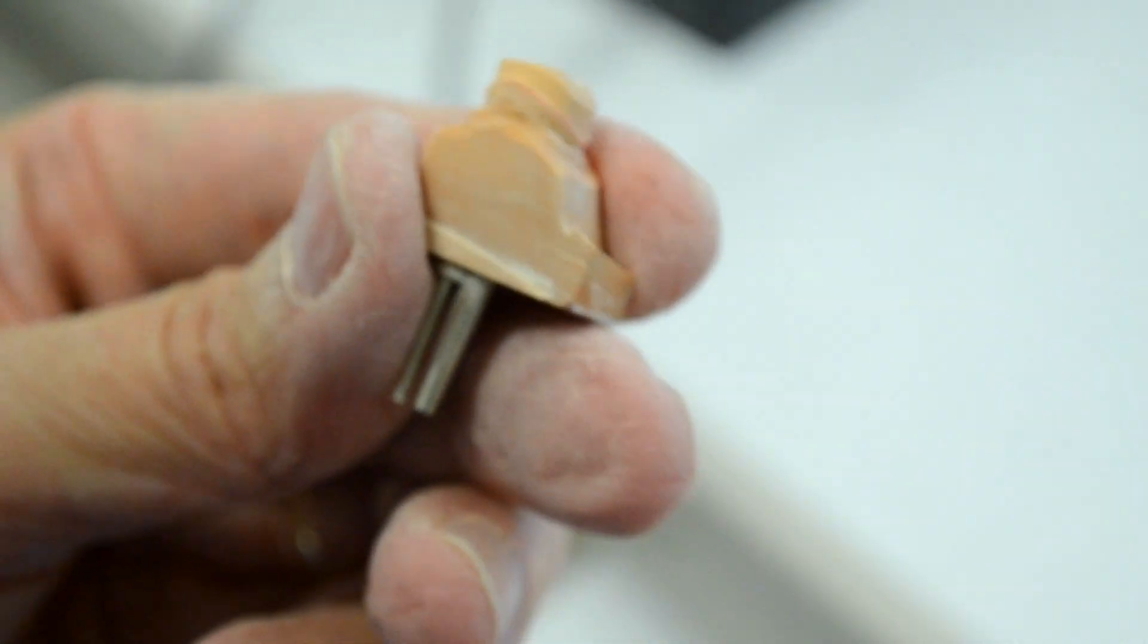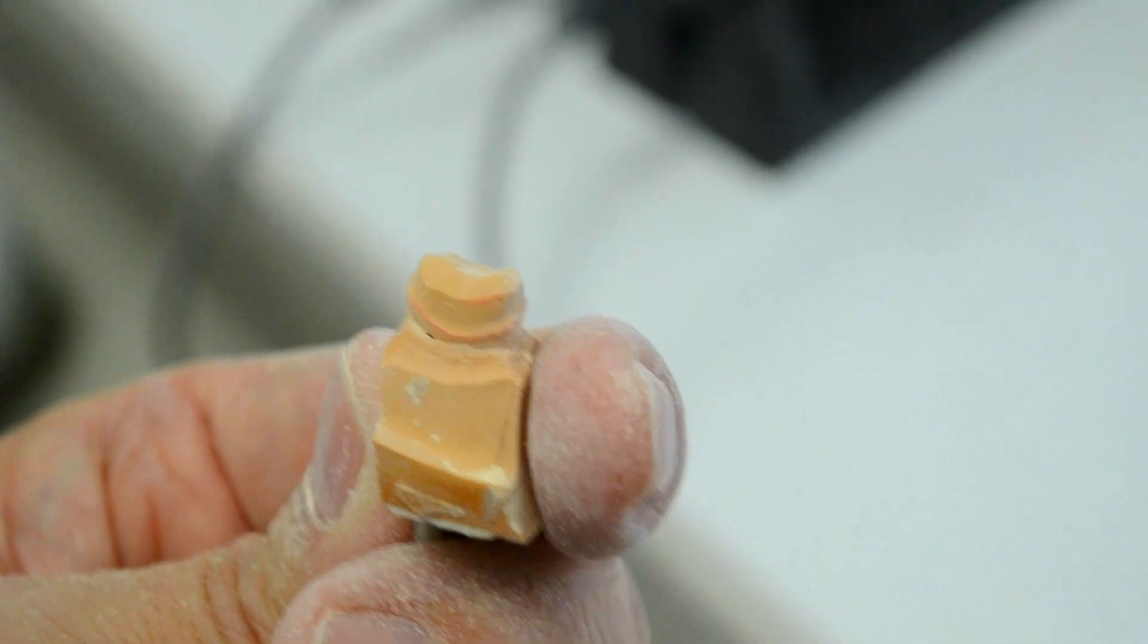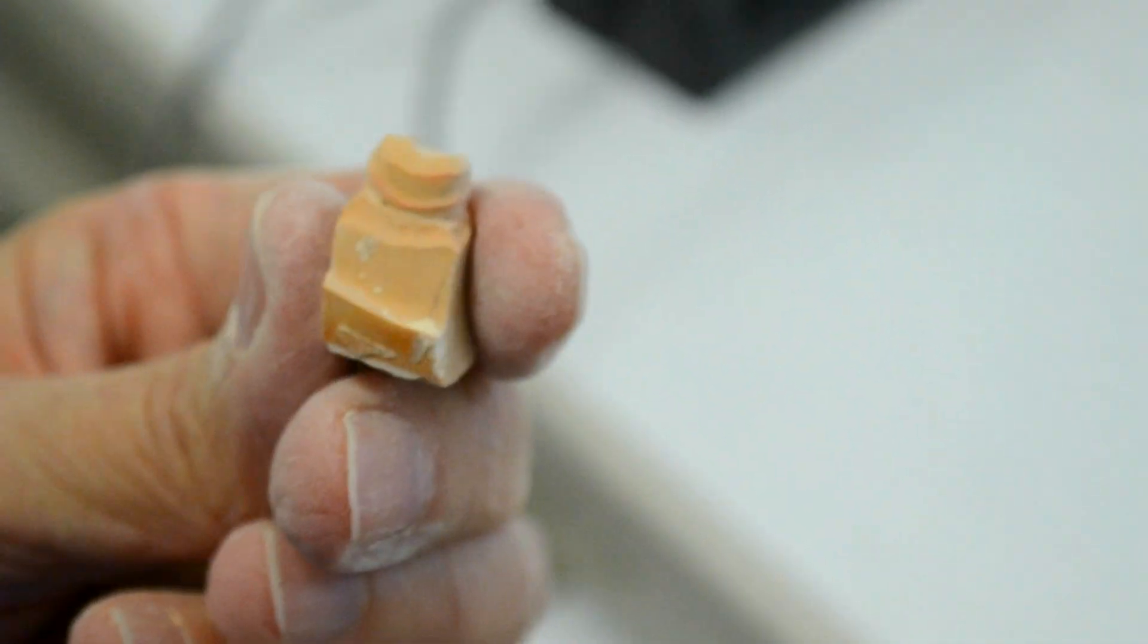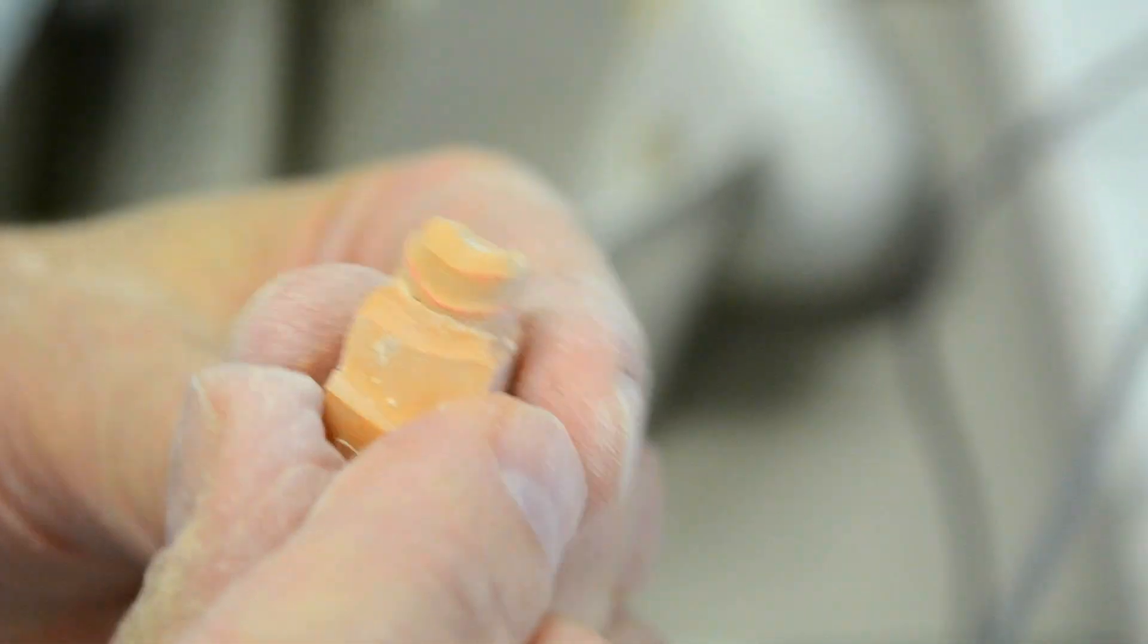And again, as you can see, the shape of the root itself along the side of the die approximates the root of this particular tooth, which is a molar. That's what we're trying to do. Any excessive trimming of the die in this particular area will result in a wax-up which is over-contoured, and that's, of course, what we're trying to avoid.